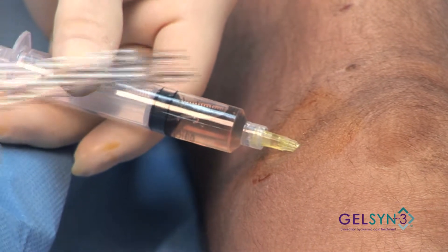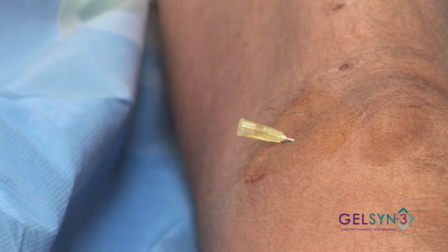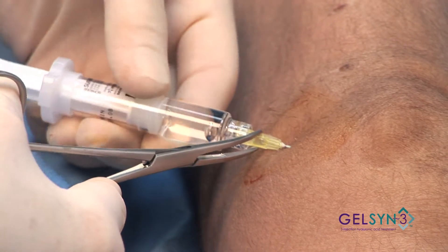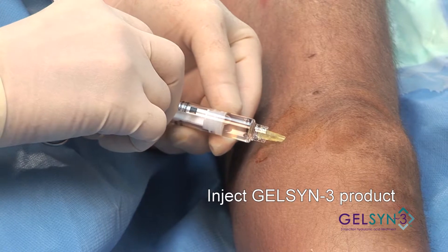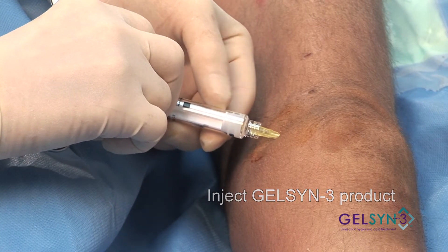And now we're aspirating the effusion. We use our hemostats to steady the needle. We know we're in the joint because we couldn't have aspirated the effusion if we were not. With a large bore needle, the product flows easily. And we're done.